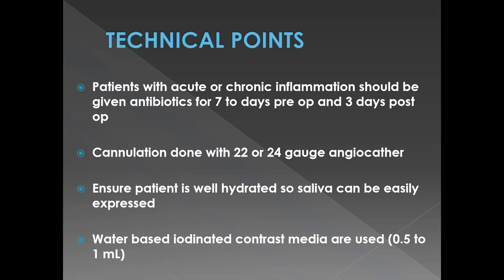It is better to use the water-based one because oil-based contrast agents are difficult for the gland to remove. Water-based ones are easily soluble and can easily travel through the duct, and they are easily removed as well. So books, especially Tucker, recommend that you use water-based contrast agents whenever you're doing sialography.